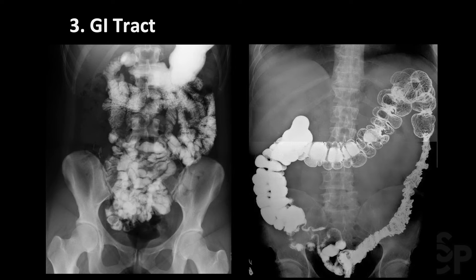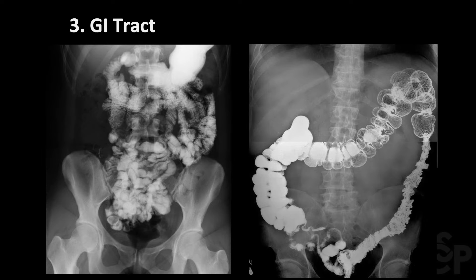The next thing we are going to assess is the GI tract. We want to identify the gastric bubble in the left upper quadrant, and then globally assess the small bowel and the large bowel. The small bowel will be located in the central abdomen and the colon will be located alongside the periphery of the abdomen. In both structures, we're looking for abnormal dilation or abnormal separation of the loops due to bowel wall thickening. On the left side of the screen, we have an x-ray from an upper GI series with small bowel follow-through, which highlights the small bowel in the central abdomen. On the right side, we have an x-ray from a barium enema, which highlights the colon. It's good to keep in mind where these structures are, especially in relation to each other.